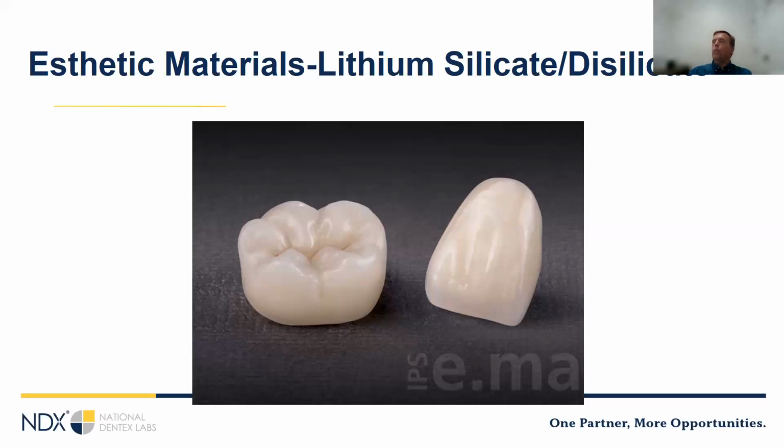Keep in mind that one of the challenges with increased translucency is it often decreases the value. So if you have a patient who wants very light, very translucent teeth, and you're trying to choose a puck or a block, if you're doing your own milling, let's say, you'll probably want to go a little bit lighter because the higher translucency will drop the value just slightly. Studies have shown that these restorations tend to be noticeably longer lived if they're bonded rather than cemented, but they are strong enough to be cemented if necessary.